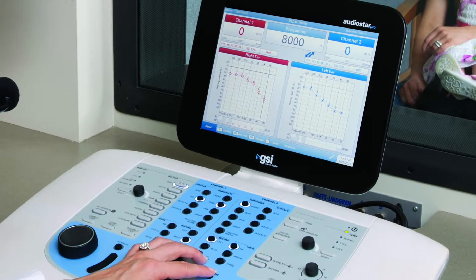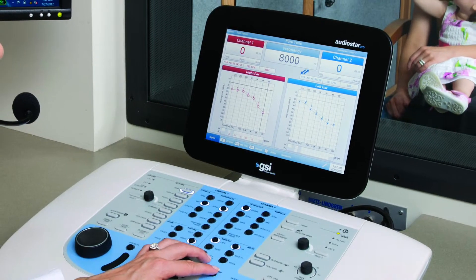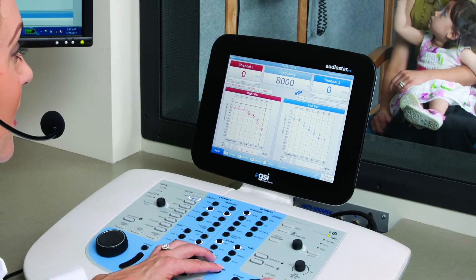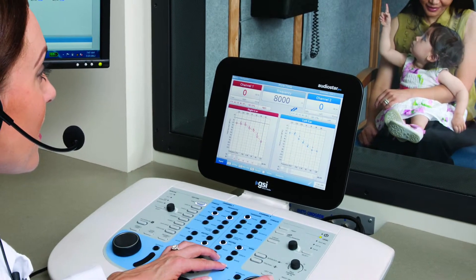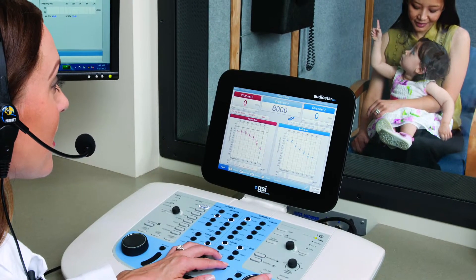Speech and noise testing provides diagnostic data that cannot be predicted by the audiogram. The AudioStar Pro offers a number of integrated speech and noise tests, including the QuickSyn and the BKB-Syn.